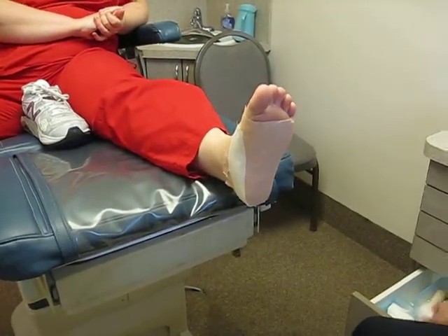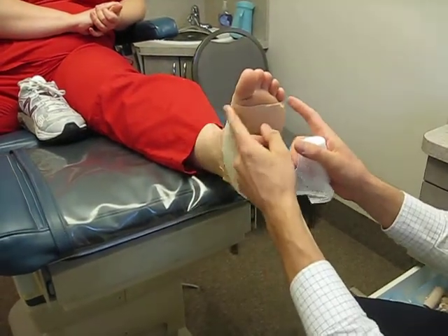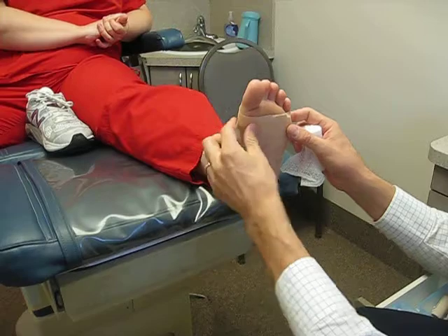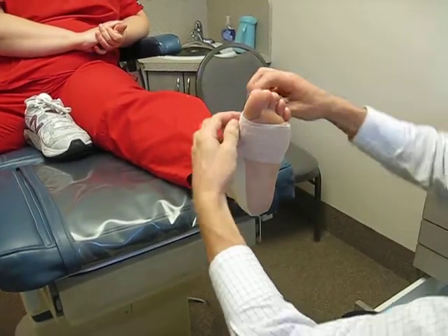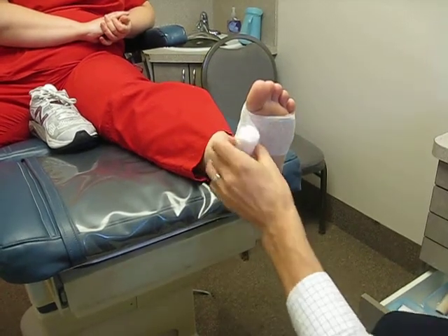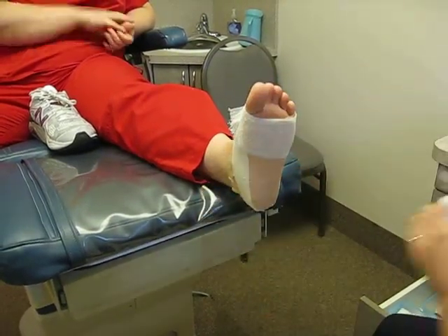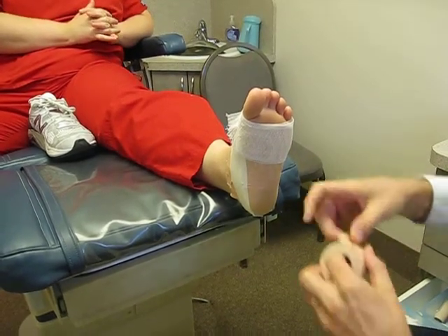Now a lot of doctors will leave it like that. I like to do another layer here because the medial and lateral aspects of the tape like to fall off when you're putting your shoes on and off. So we add a few layers of gauze, then come back to the 2 inch tape again.